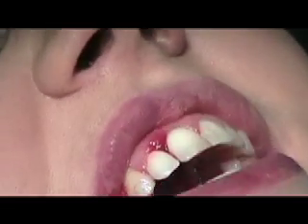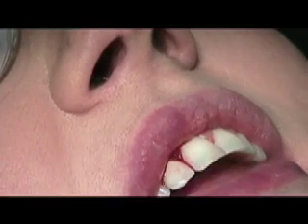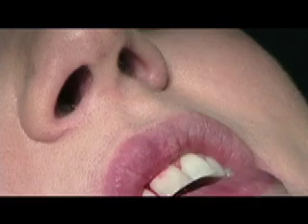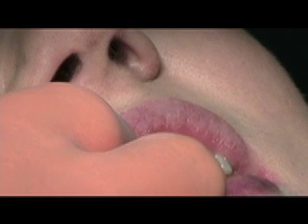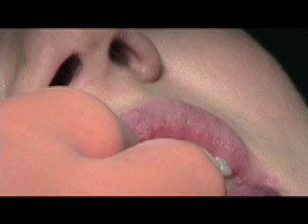Didn't bother you? That's great. It's like nothing that you can't handle. Very easy. And this is your second procedure? Yeah. I think it's the anticipation that makes you more nervous than the procedure. So you think the laser is the way to go? Yeah. Keep the flossing and make sure we keep the minimum amount of bacteria around the teeth, because that's what's stimulating the blood vessels to overgrow.